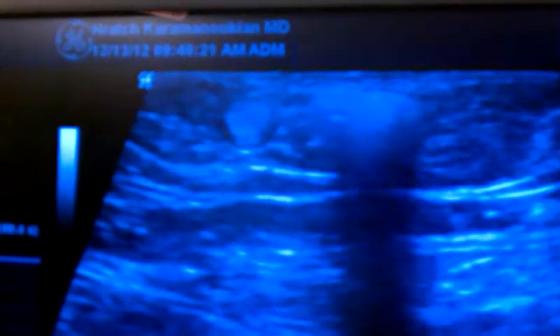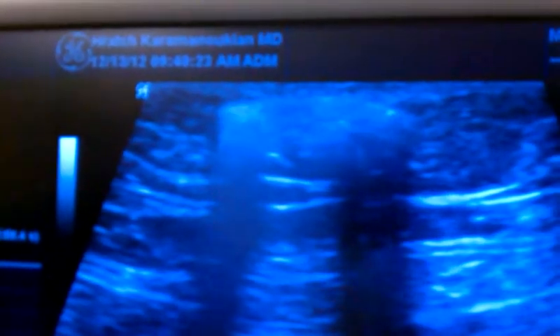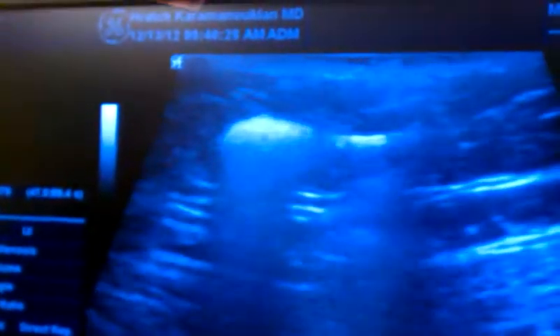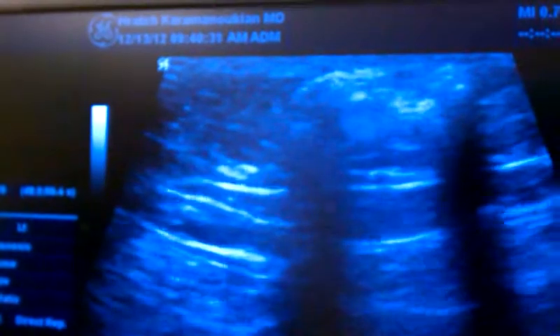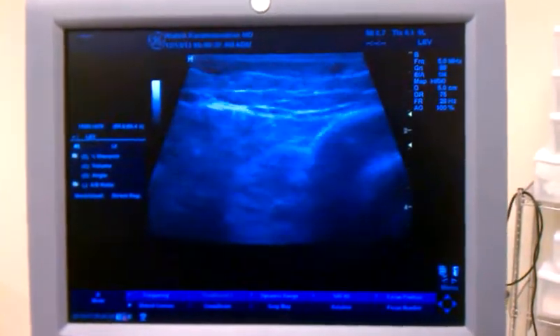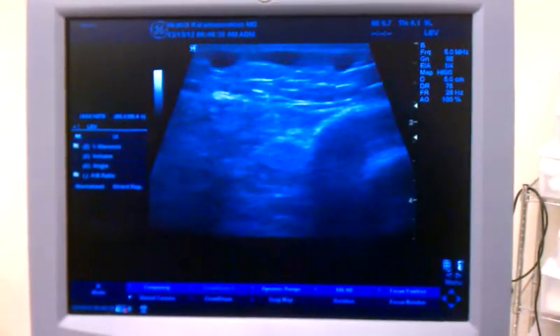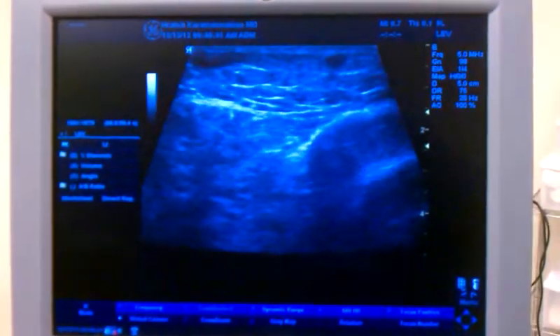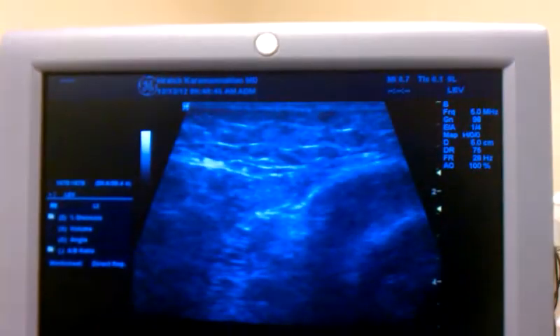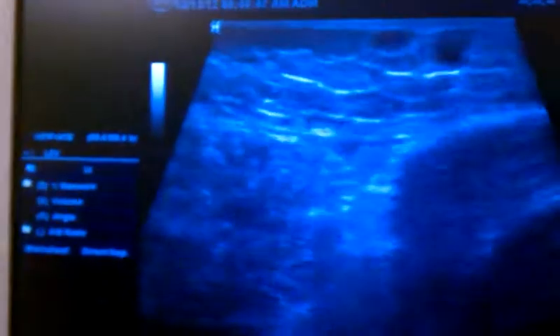And then you'll see the sclerosing solution, which in this case is Asclera — A-S-C-L-E-R-A — which is polidocanol. And down here, we're going to go below the knee now, so we always inject higher and then come lower, so that we can visualize all the segments. That's a technique I use.